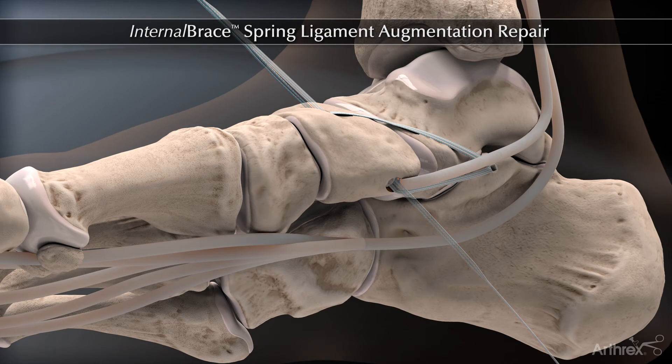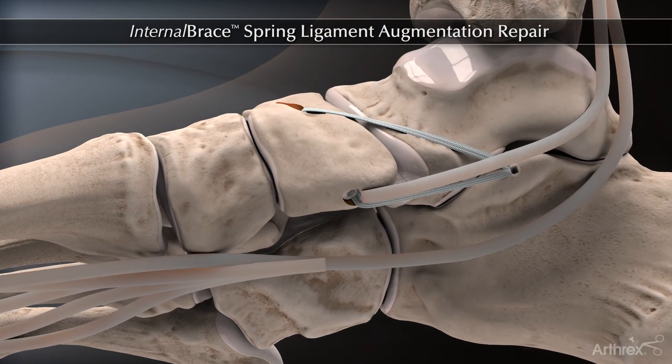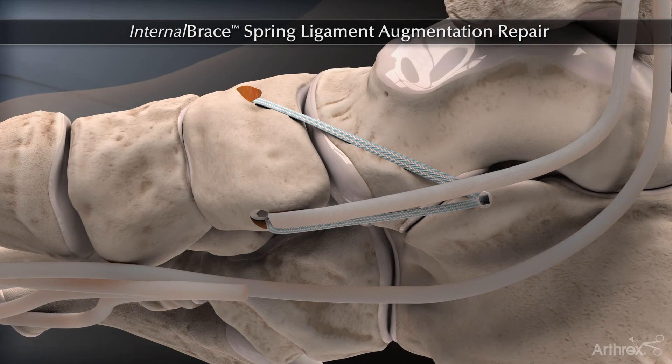Finally, the remaining tails of the fiber tape and extra limb of the FDL are removed, creating the final construct.